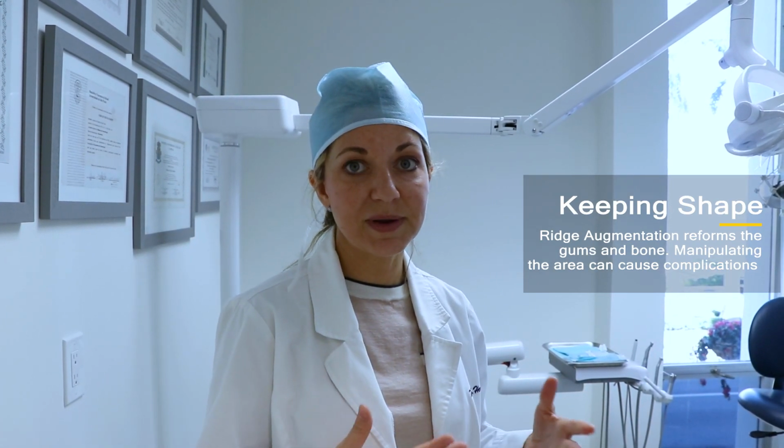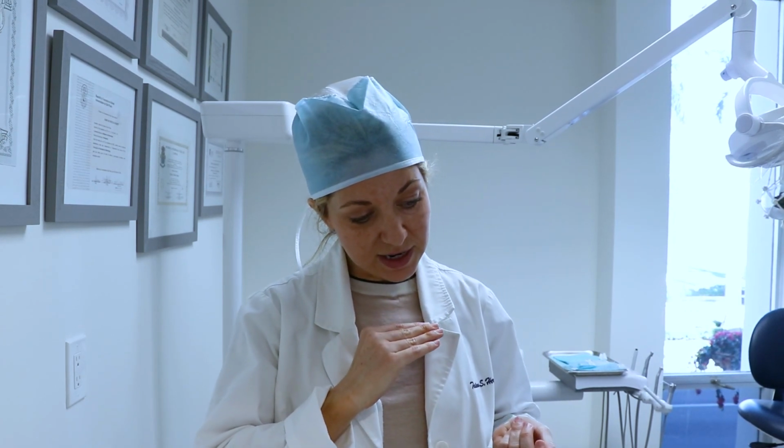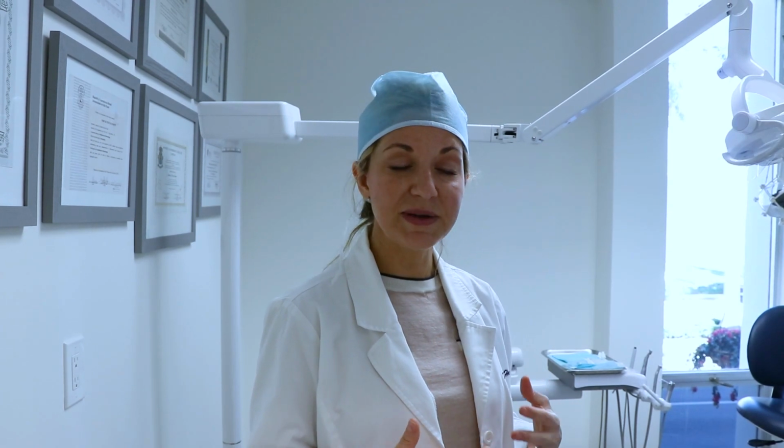For these procedures, sometimes I'll prescribe a steroid so that you don't have inflammation. You might have seen during the procedure, or you might see during the procedure, I am actually using a blade to release the tissue so that I can stretch that tissue over the new bone. And this is something that does cause inflammation. It causes a little bit of pain and a little bit of swelling, but if the patient is really good about putting ice and taking the steroids, then they really should have no pain or inflammation at all. So that is ridge augmentation.